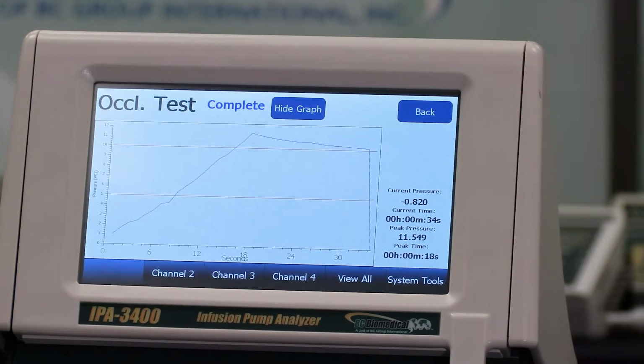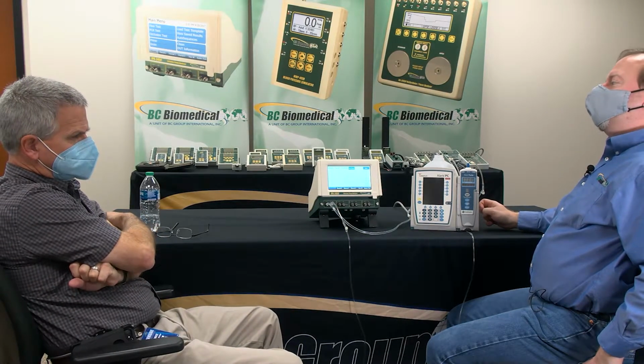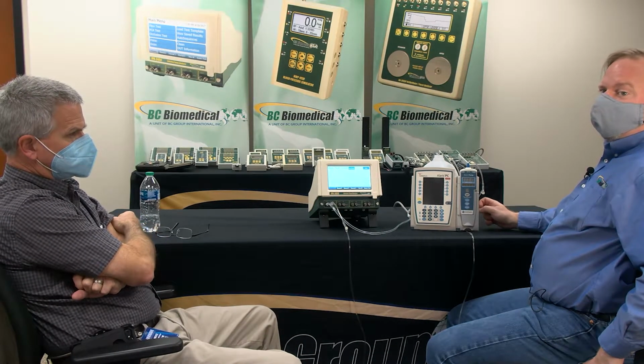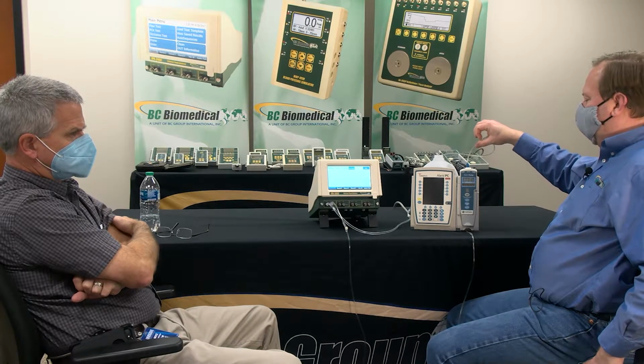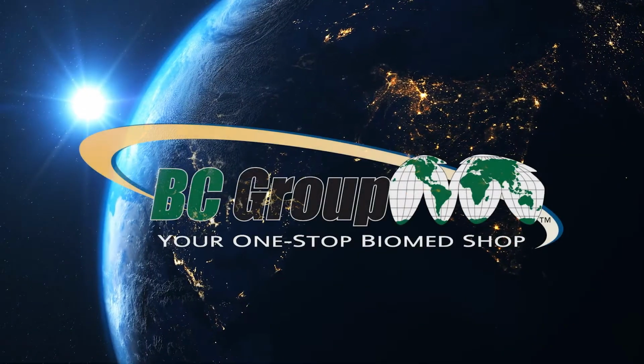But let's just get the fluid into the pump. Doesn't the pump provide the pressure? It provides the pressure coming out. Yeah. Right. And that's what our back pressure is. Well, that's why I was wondering, what's the validity of the balancing that they're doing? It is very effective in creating a constant head, input pressure. Yeah. Very effective.